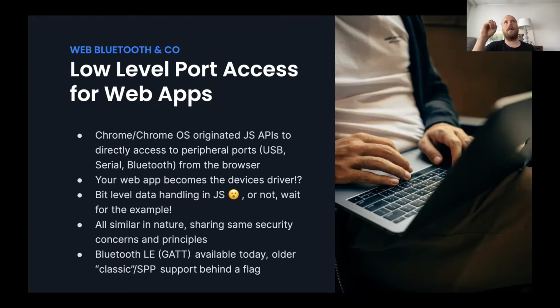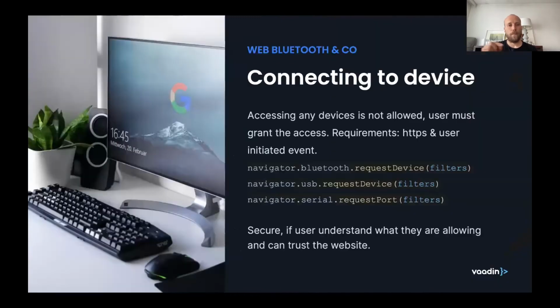And this is not available even in Chrome by default yet, but you can enable that if you open the flags tab in Chrome, and this way you can get this experimental feature enabled. But we will see if that ever becomes enabled by default. So I would highly suggest to prefer these Bluetooth or Bluetooth low energy devices instead.